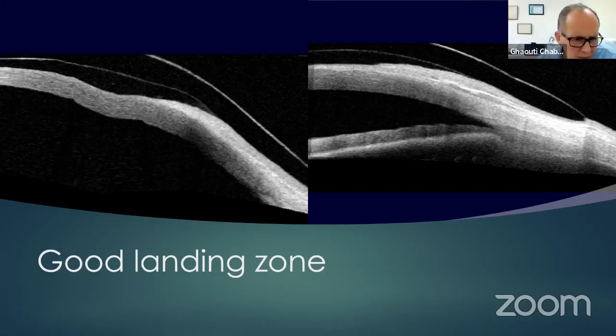On my regular scleral lens designs, forget about the eye print, on the regular scleral lens designs, I always fit lenses with reverse geometry. And usually, as far as the secondary curve is concerned, it's 4 diopters steeper than the base curve. So my regular standard scleral lens designs are all reverse geometry. That helps me give a lift over the limbus. It just makes for a better fitting lens. I don't get edge lift off that way.